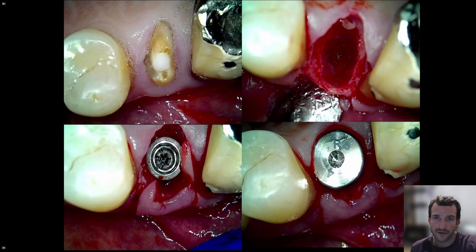Hey guys, Dr. Dobson here. I'm going to be going over a quick upper right premolar immediate implant surgery in this case.